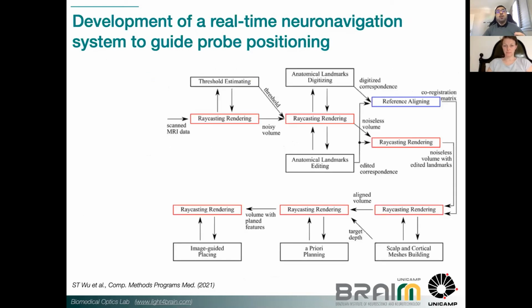So we said, well, maybe we should be able to track where each optode is and try to neuronavigate in real time with the probe before we start the experiment, because at least we guarantee that we are, it can be not a good sensitivity, and that's a problem with the experimental setup, but at least it's going to be the same, so that will actually decrease your variability.